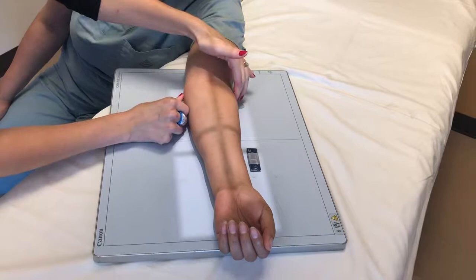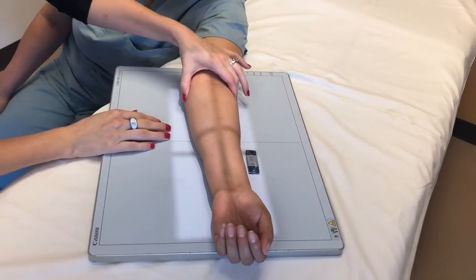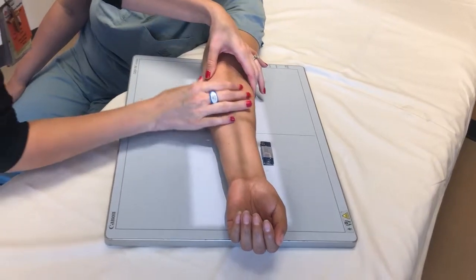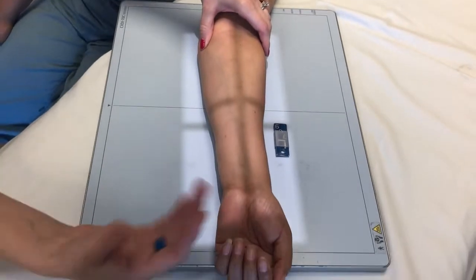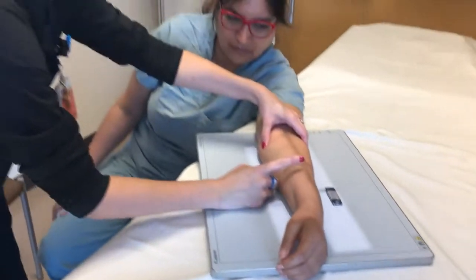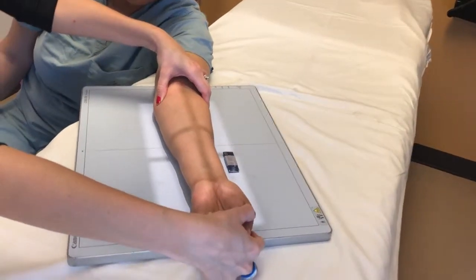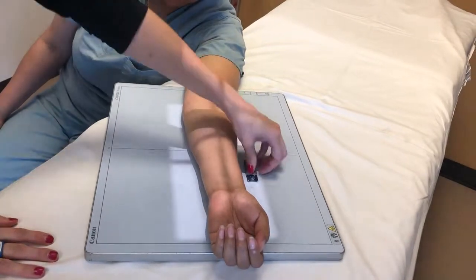One thing you want to make sure of is the condyles of the elbow. You want to make sure that they are parallel to the cassette plane itself. So if you palpate, if your patient's going to let you, palpate for those and adjust accordingly, okay? Another thing that some patients may do is they may leave their wrist crossed like this. That's a no-no because the radius and ulna cross at the mid shaft. So you want to make sure that you bring that back to an AP position just like that, so the radius and ulna are fully evaluated, not superimposed by anything else.